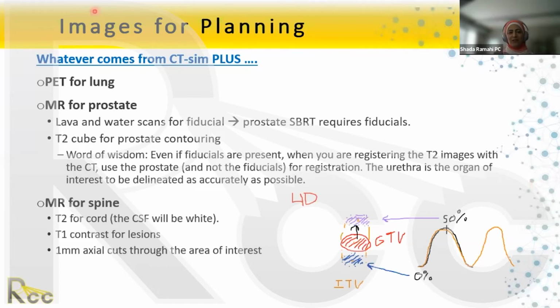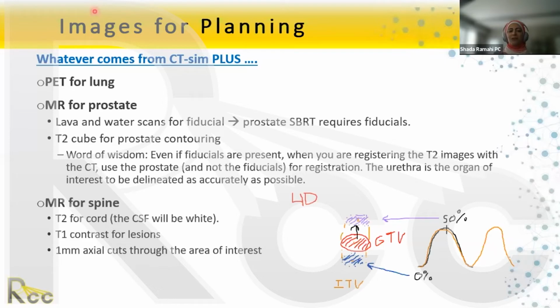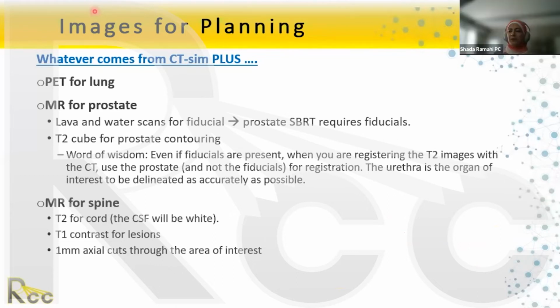So now you've done your CT simulation. You pushed the CT sim to the planning system. What other images do you need? Clearly for lung, you already have a PET scan. I guess this is very well known, very popular.